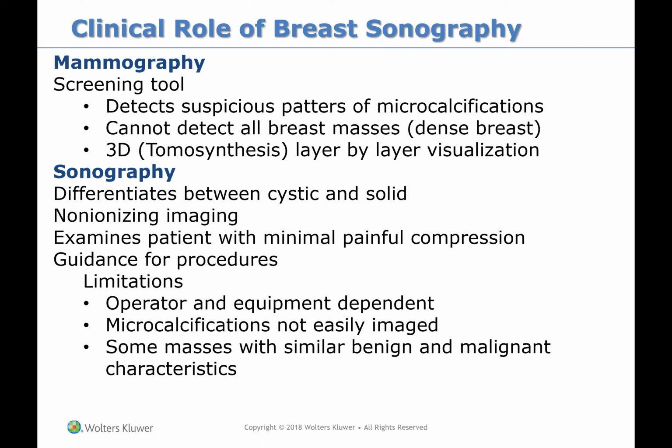It examines the patient with minimal painful compression. Like with mammography, your breast is compressed, so it can be uncomfortable. It also is used for guidance for procedures. If a patient has a mass, sonography usually does an ultrasound guided biopsy of the breast to take some tissue to check to see if it's cancer.